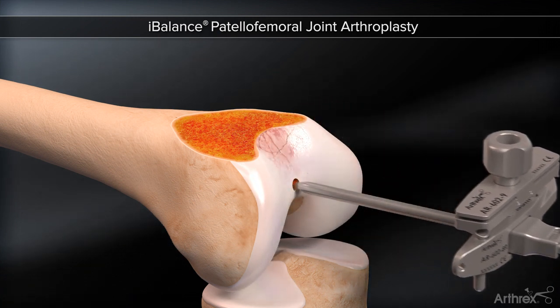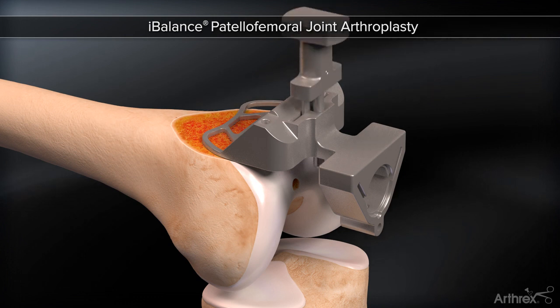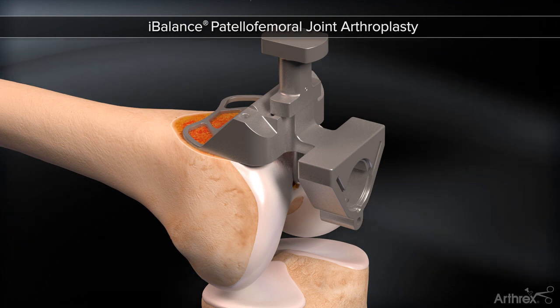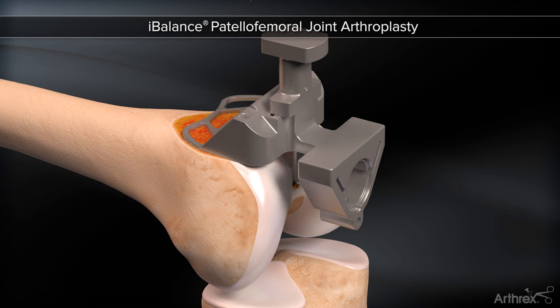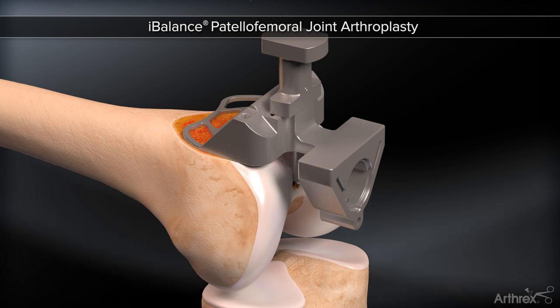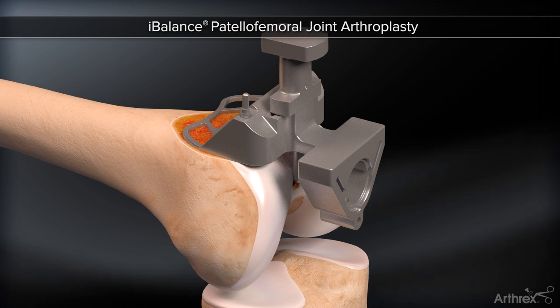Proper component size is established through size-specific finishing guides. A proximal position stylus rests on the articular cartilage, defining proper proximal-distal position. Proper size ensures the component will not overhang at the anterior lateral aspect, as represented by the shape of the finishing guide. Headed pins secure the block into place and the stylus is removed.